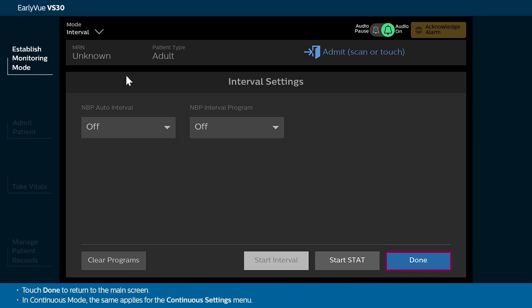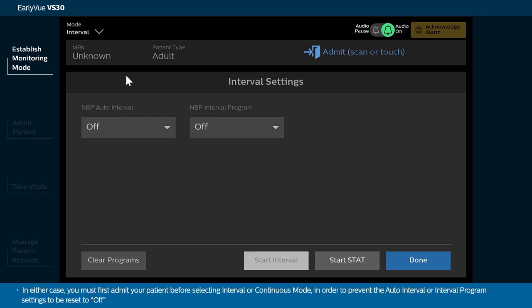Touch Done to return to the main screen. In continuous mode, the same applies for the Continuous Settings menu. In either case, you must first admit your patient before selecting Interval or Continuous mode in order to prevent the Auto Interval or Interval program settings from being reset to Off.